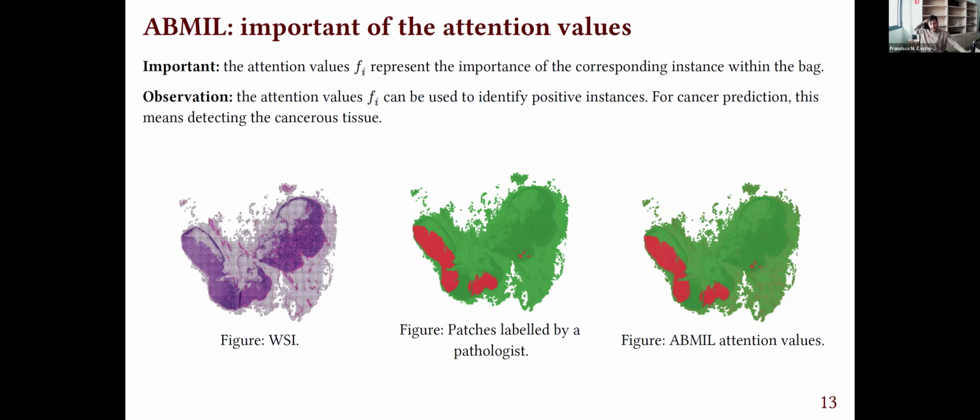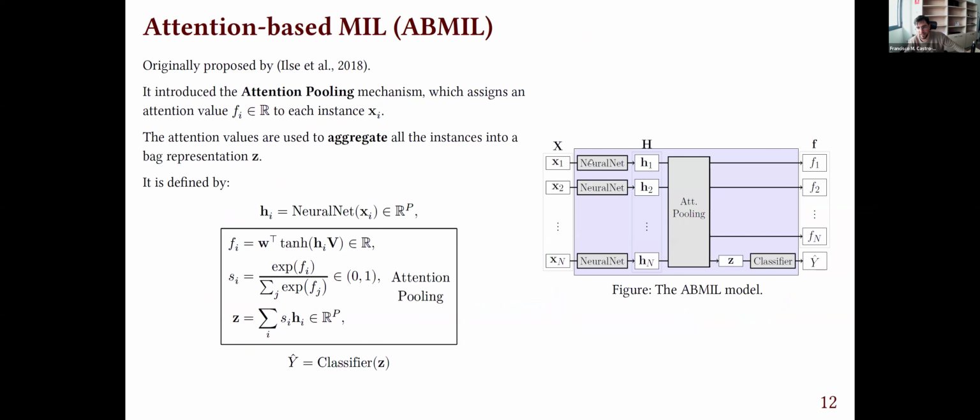Here Jasmina says, does the use of overlapping and non-overlapping patches affect MIL performance? Yeah. In my experience, I say this a lot, but if you use a good feature extractor here, a good neural network here, if the mechanism you use to extract features from your patches is good enough, you won't need to use overlapping patches.